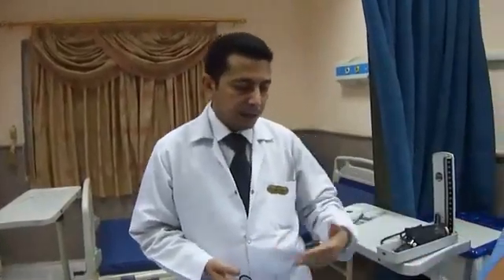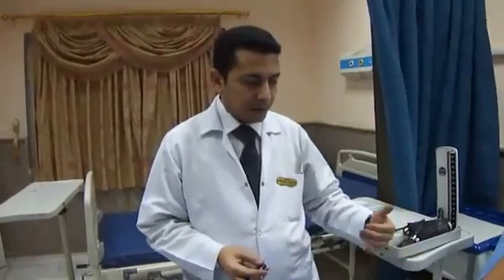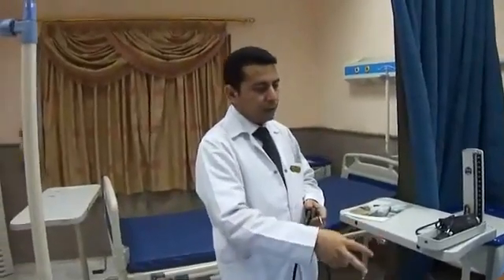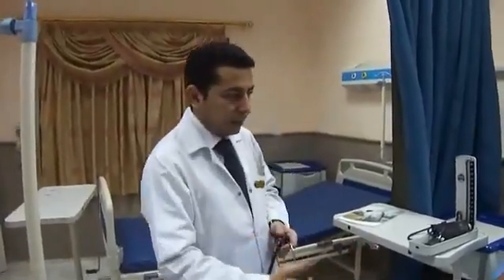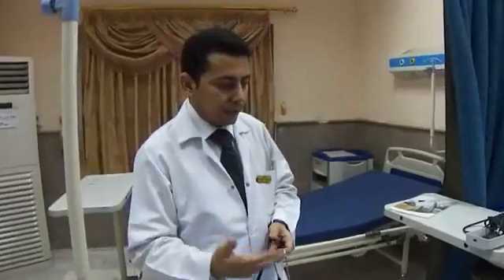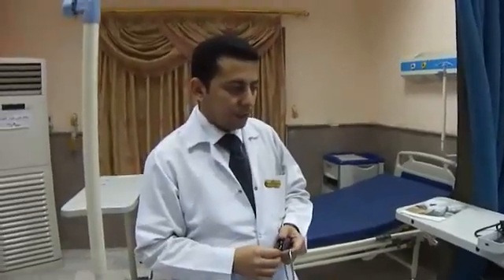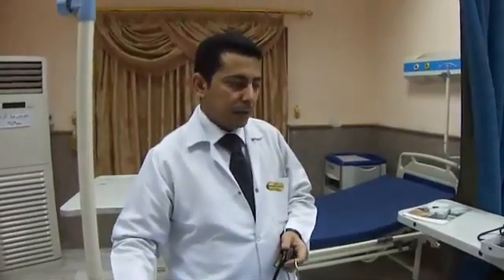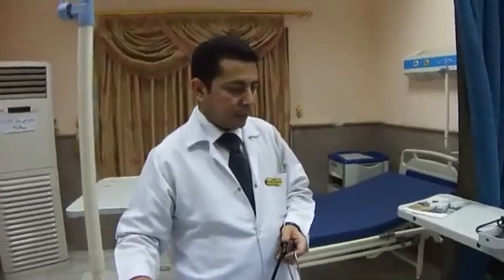Blood pressure should be repeated after a period of about five minutes, and then repeated on the left side — the highest reading is taken. When the patient is young, blood pressure should also be taken at the legs and the upper limb. If the patient is suspected to have autonomic dysfunction, hypovolemia, or is elderly, one should also measure supine and standing blood pressure. These are all the key issues regarding blood pressure measurement.